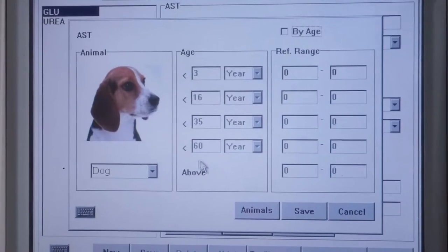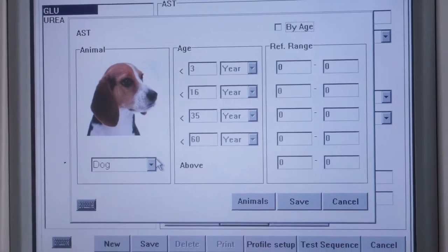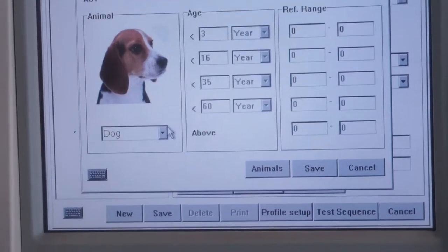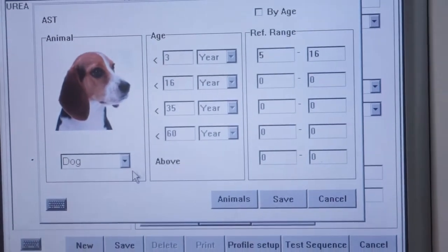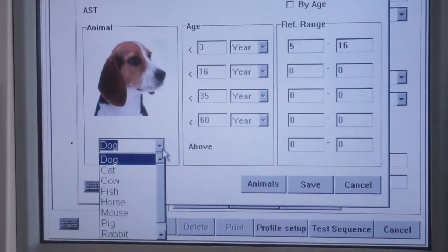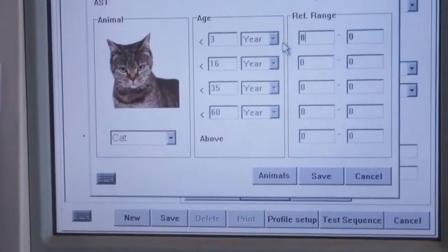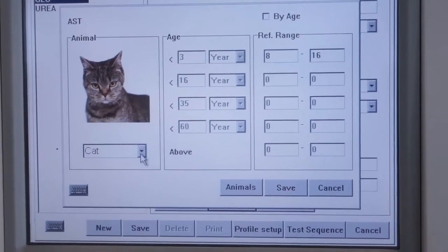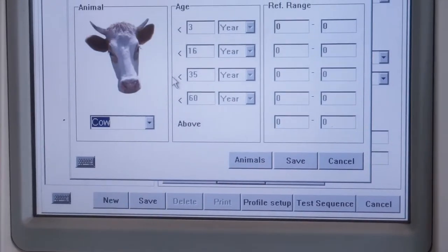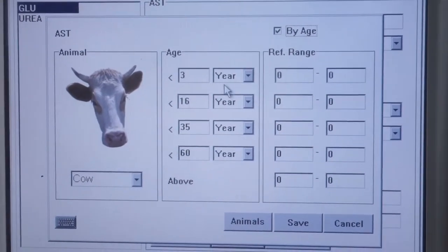And for the different range, different animals in different areas have a different range. So the doctor will know the range. I just import it, for example, for the range, we can see in here. This is the range for the dog. If you have another animal you need to test, you can also choose the cat, right? You put the range. So for example, A260. Okay. And also if you need to test another animal, for example, cow. Also, if you have animals by age, you can choose age. Each age has a different range, you can see.